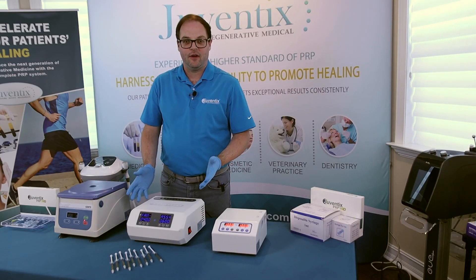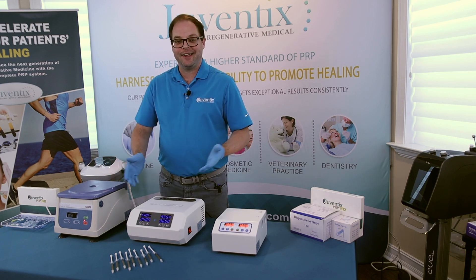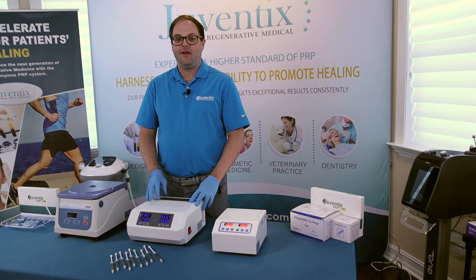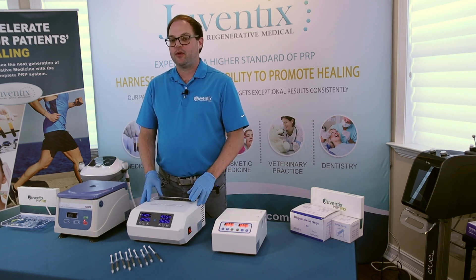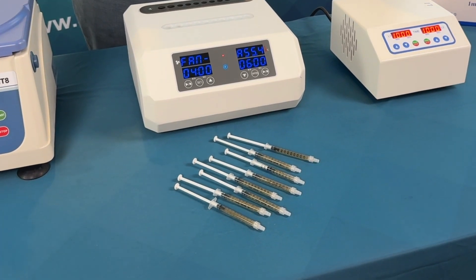Because we're using equine blood for today's demonstration, our horse wasn't well hydrated when he was our donor. We got about 9.5 cc's of prepared PRP out of a 20 cc blood draw. When working with a human that's properly hydrated, this will typically yield about 10 to 12 cc's of PRP.